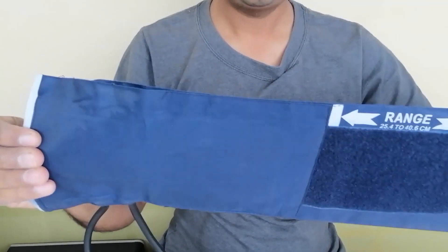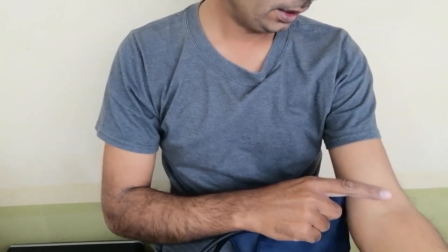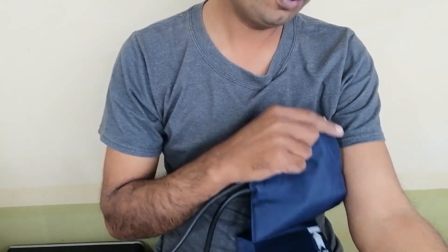First we tie the cuff to the arm. This is our cuff. We tie it on the arm. Before tying, note that there should not be any kind of cloth on the arm.